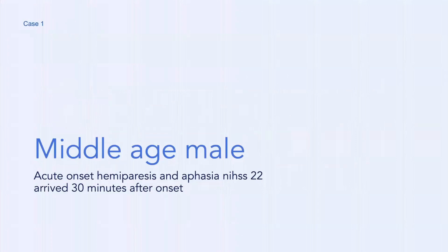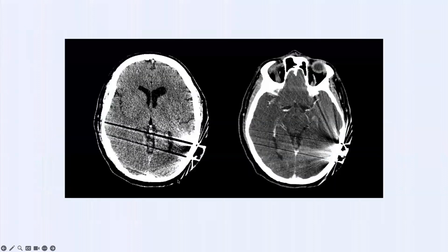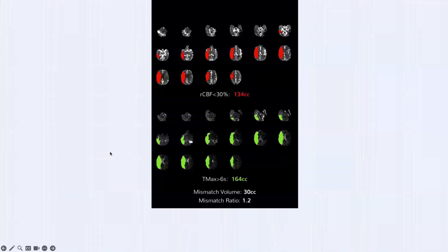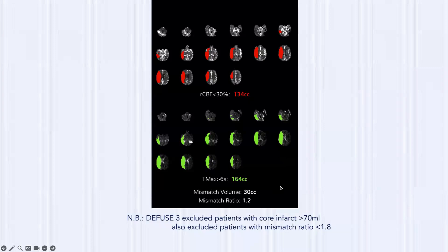Middle-aged male with acute onset left hemiparesis, aphasia, NIH Stroke Scale 22, arrived within 30 minutes of onset — important detail. The brain CT has tremendous streak artifact from a cochlear implant, but CTA shows no right MCA vessels, confirmed on coronal reformat. CT perfusion: CBF <30% = 134 cc's of core infarct; Tmax >6s = 164 cc's; mismatch volume only 30 cc's; mismatch ratio 1.2. In DEFUSE 3, core >70 cc's was excluded — this is nearly double. But this patient came in within 30 minutes, not the 6–24 hour window of DEFUSE 3.